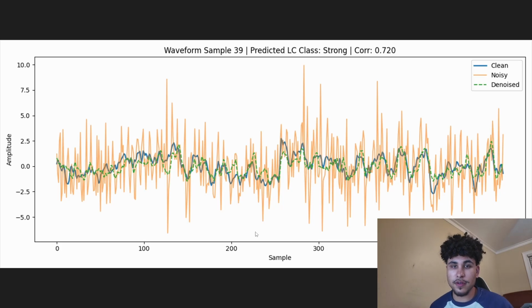This is a graphic that shows how the model performed on heavy amounts of noise. So the orange line is the noisy data, the blue line is the clean EEG signal, and the green line is the model's reconstruction. Now, the model reconstructs the signal at about 72% accuracy, and on average it gets in between 70 and 80% accuracy on stronger signals. Now, although that doesn't sound great, this is unrealistic for most scenarios regarding EEG data.